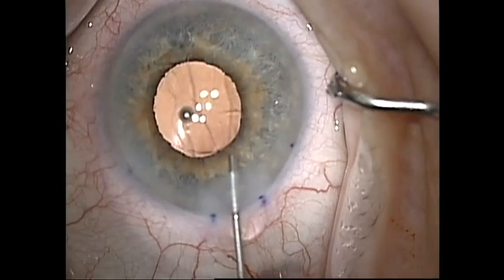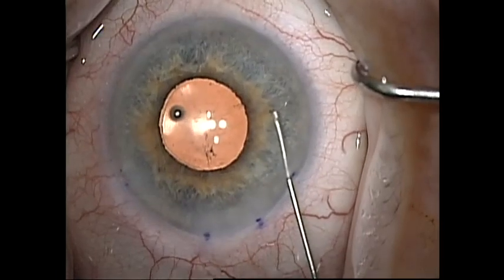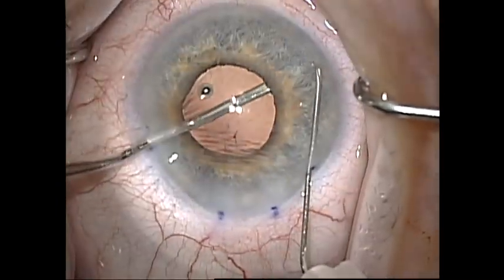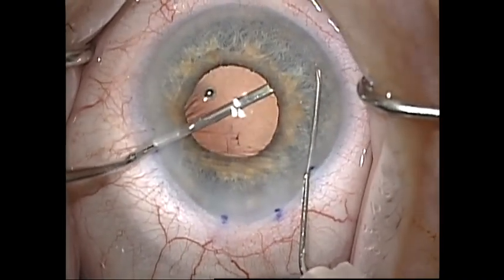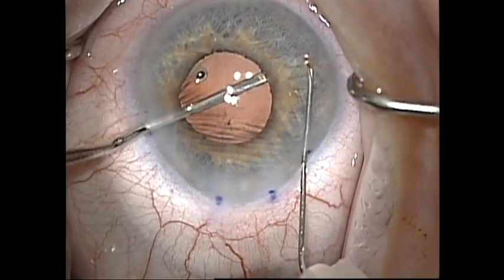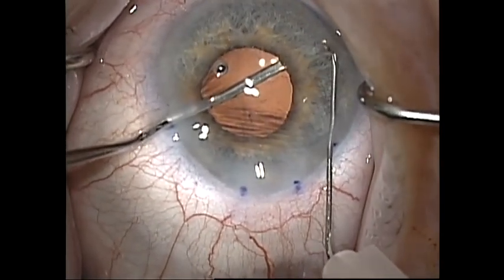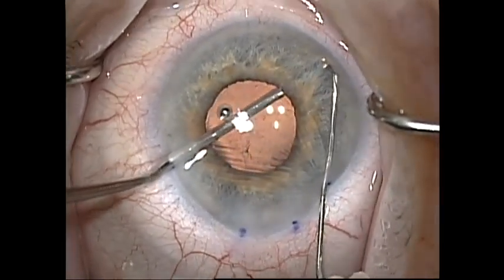I then refill the anterior chamber with a cohesive viscoelastic and perform the peripheral iridotomy. I use a bent 30-gauge needle and a peripheral iridotomy tool I designed with Storz Ophthalmic. This tool has a groove that you can run the needle into to help make the iridotomy. It also has a bulbous tip that will not injure the posterior aspect of the iris like a sharp tool could, which can cause bleeding or disinsertion of the iris root. I scratch down on the tip of the tool and then use the two tools to stretch the hole open. This stretching action is probably sufficient for creation of a PI, but I then enhance the peripheral iridotomy with a pair of micro scissors.